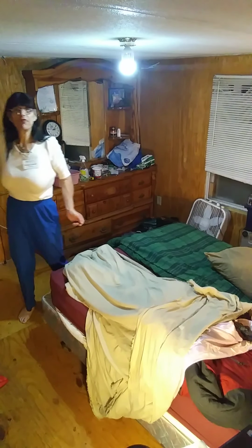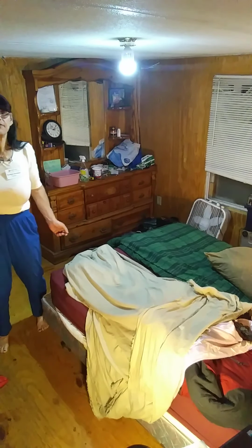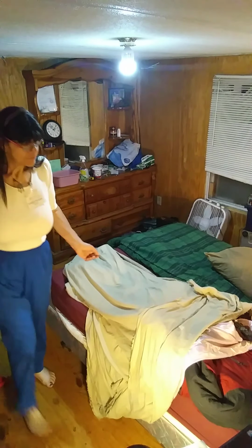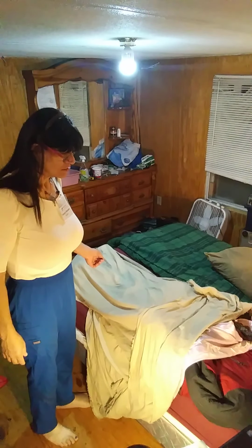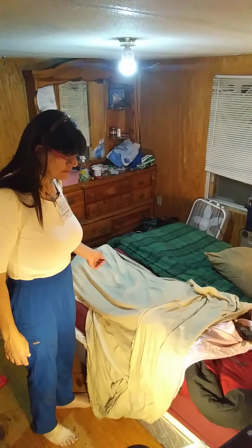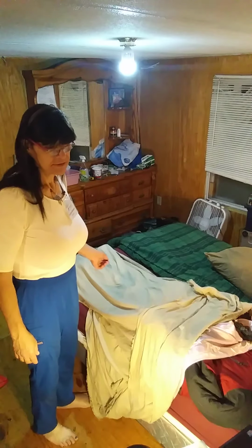I'm going to remove privacy. I'm going to open the curtain up. Miss Cheswick, would you like your door open or closed? You want it open? Okay. Is there anything else I can get you today? No? Okay. Wash hands. Skill complete.